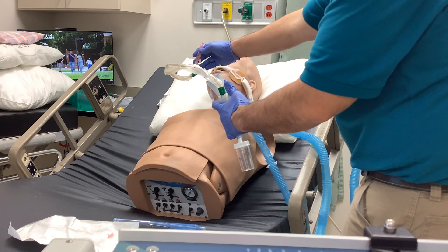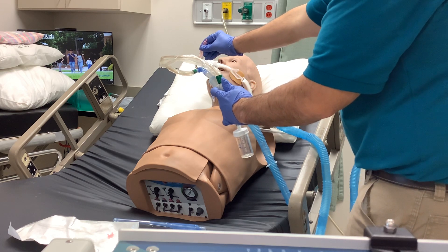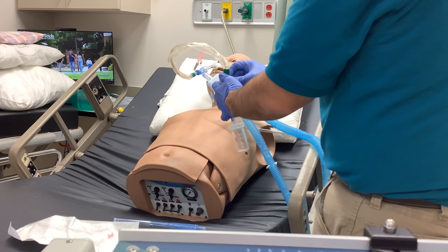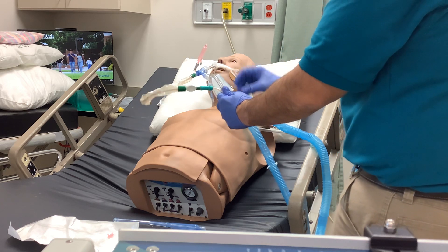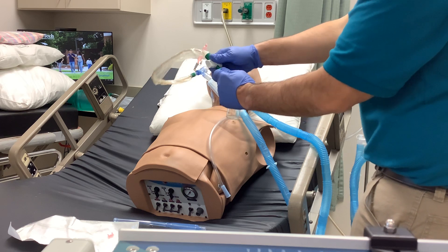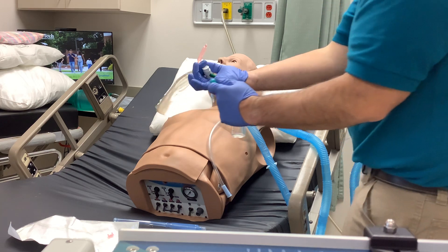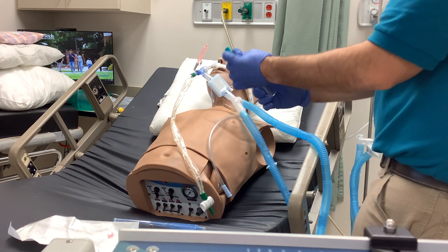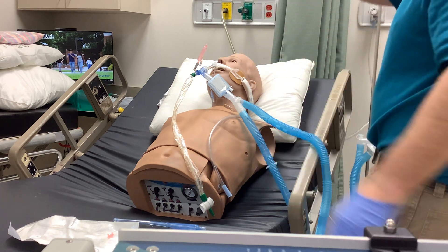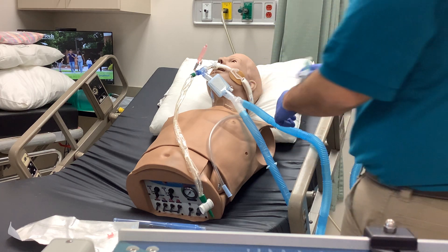Utilize your saline bullet — your lavage — and apply suction to clear that catheter out. Then you can remove the setup. I would go ahead and remove your suction source first so you don't lose anything. Pull this out. I've already locked that back in place. Take that, crimp it over. Put your label on it and send it down. You can see the sample that's been collected inside — that's your sputum sample ready to send off.